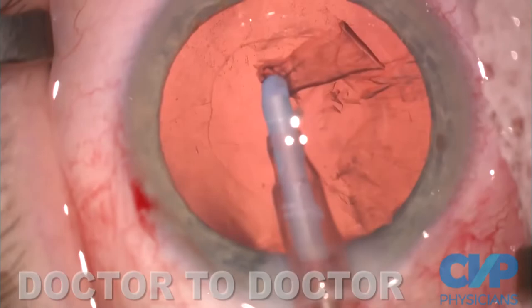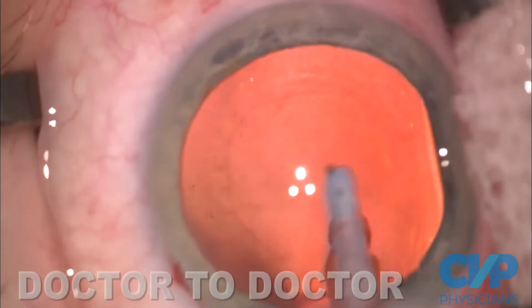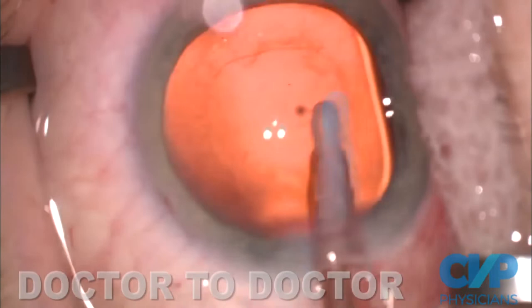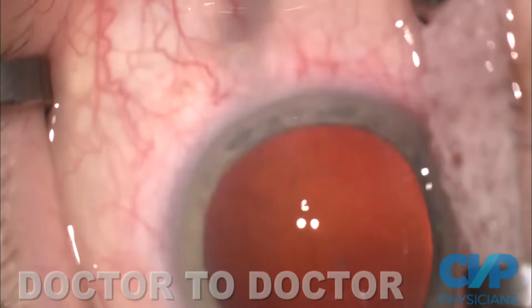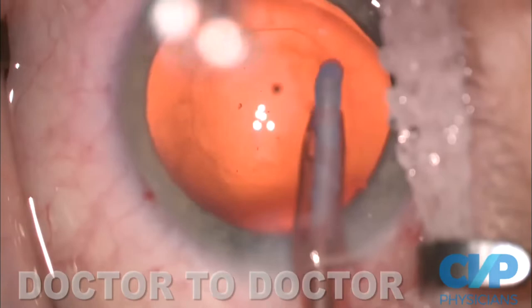I work my way around, trying to get various meridians crystal clear. I'm not a fast surgeon — I just take my time. When the final piece is out, I inspect. If there's any cortex left, I go after it with a dry technique, but there's not. I've always polished very carefully and thoroughly the central capsule. Then I polish the peripheral capsule as well — my son is a retinal specialist and insists on a good view of the periphery. All the capsule is completely clear. If I have loose zonules or concern about capsulophimosis, I will polish the anterior capsule, but I don't do that routinely.